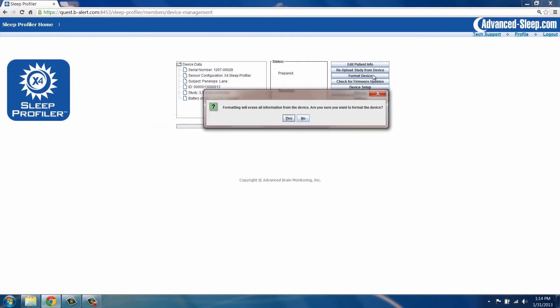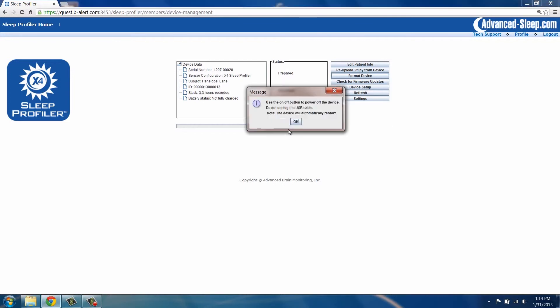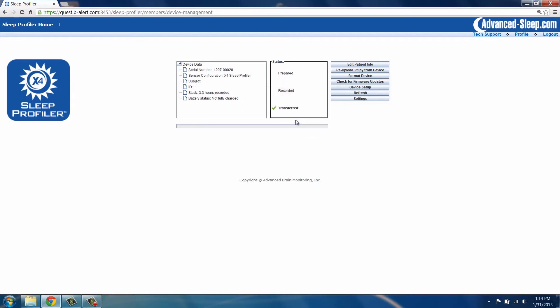Formatting will remove old study data from the device memory. Click Yes to confirm that the existing study information may be deleted. To complete formatting, you will be instructed to turn the device off while the device remains connected to the portal. After a few seconds, the device will automatically turn back on.